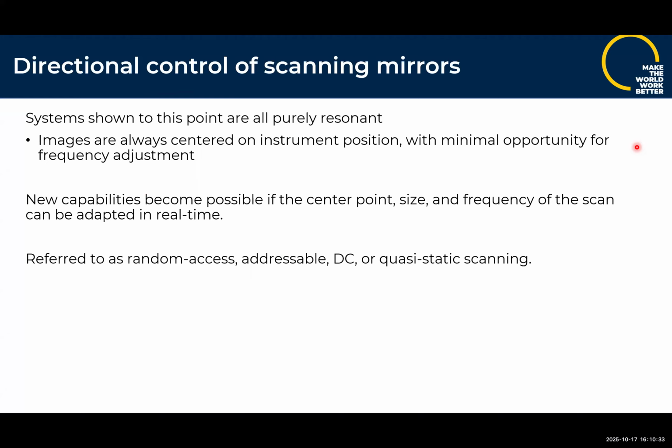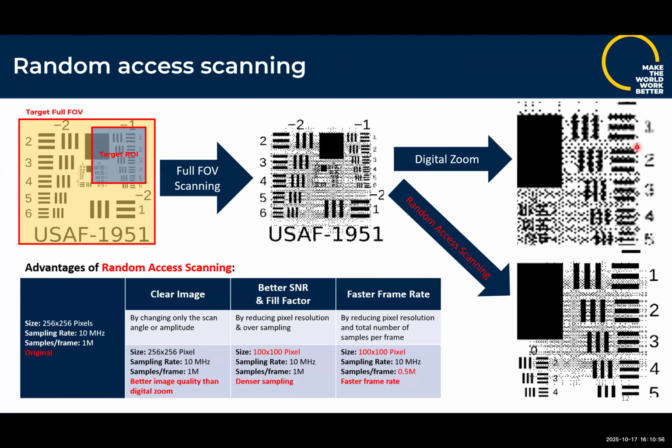Piezoelectric scanners have enough work density on board that you can take a relatively stiff device, necessary for high frequency scanning, and provide enough actuation force to give it substantial DC offset. And so that allows us to potentially implement something called random access scanning. It also potentially frees up real estate due to the higher work density of the devices.